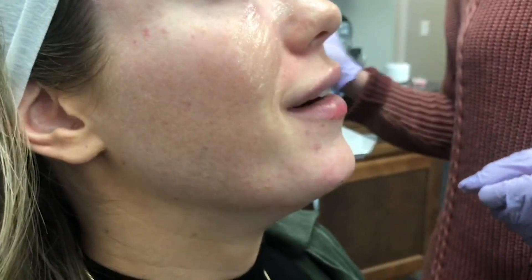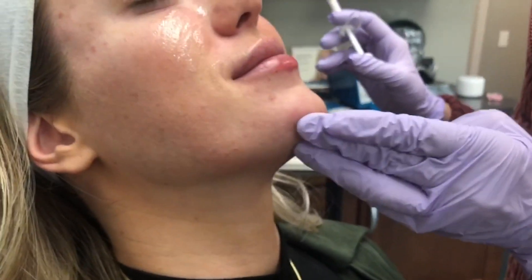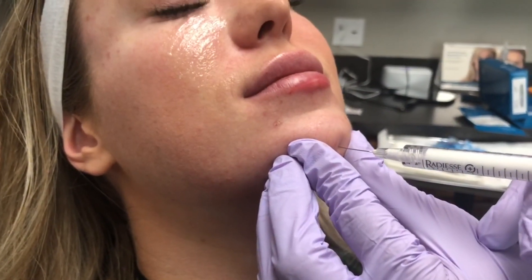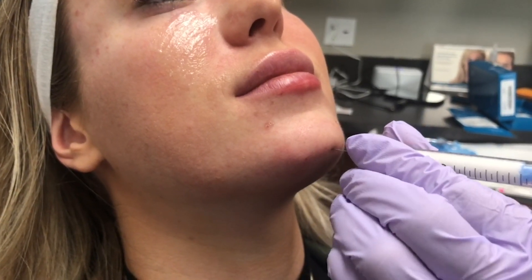Product has been placed and we are sitting the patient up. Always examine your patients from all angles in the chair — this is how you're going to make sure that everything looks symmetrical. You might pick up on a deficiency or an area that requires more attention once they're sitting forward. So sit them up, look at them from all angles, and then reevaluate where your next step is going to be.